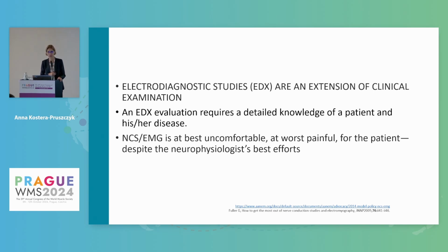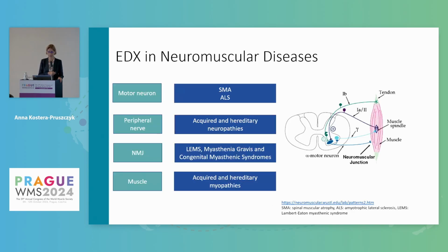There is more limited use for pediatric patients, also because the method is quite painful and uncomfortable for a child, and we also have much better access to other important diagnostic methods that we have already heard about, and we will speak more about during this workshop. Of course, electrodiagnostics in neuromuscular diseases has some advantages, but also some limitations. It will really not give us a precise diagnosis, but it might give us good insight into the level of lesion, going through the whole peripheral nervous system.